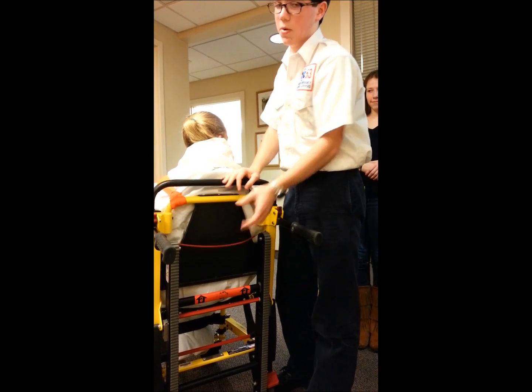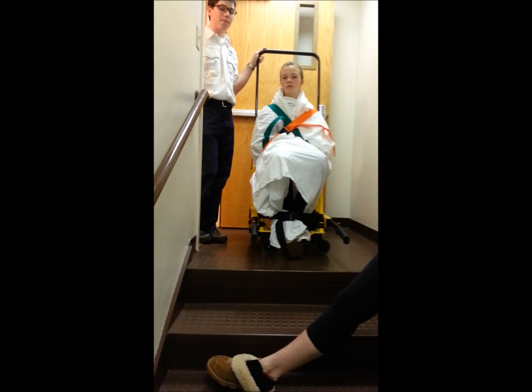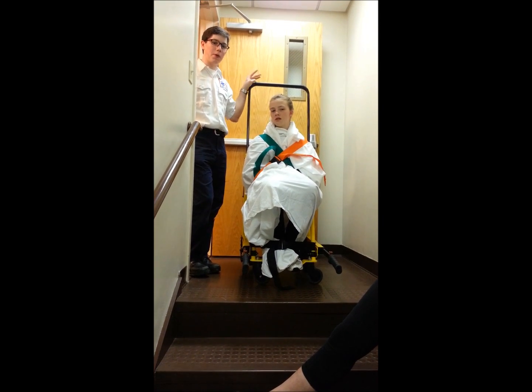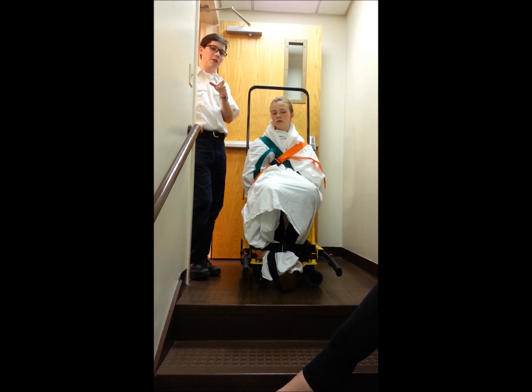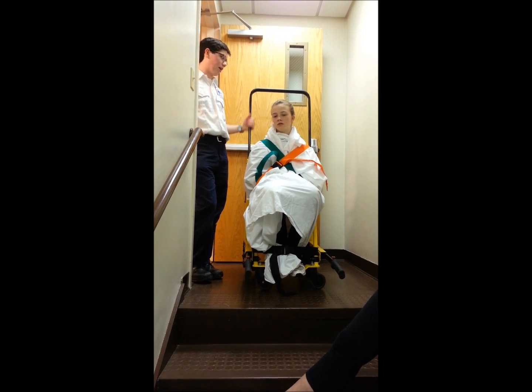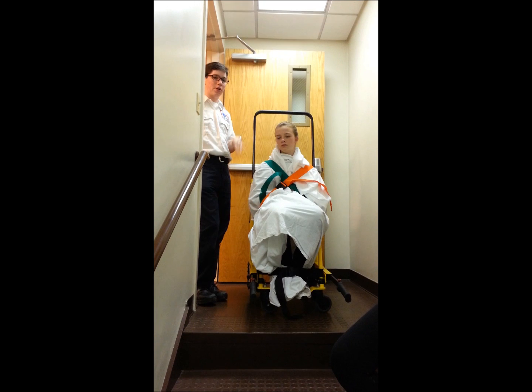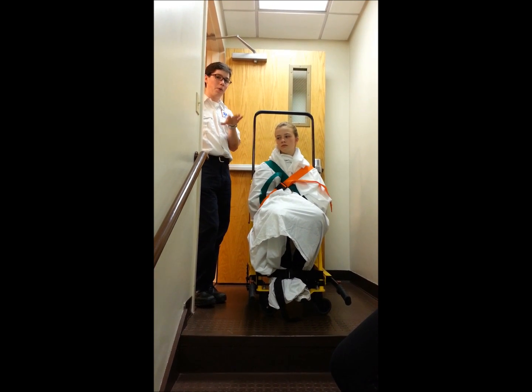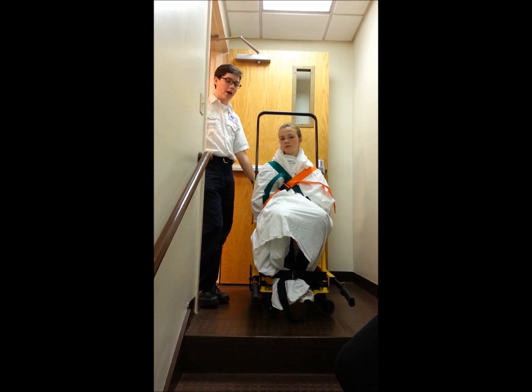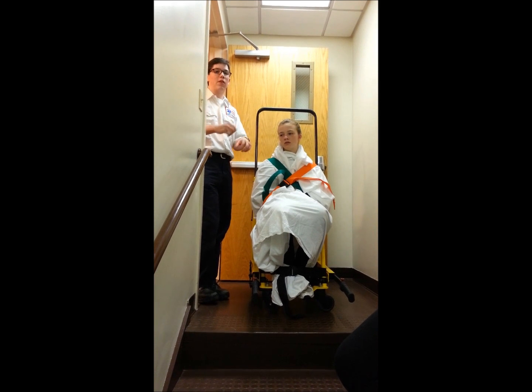So now the next part is we're going to bring this patient down the stairs. In terms of lifting and moving the patient, you're going to have three people: one spotting, one lifting down there, one lifting up here. The person up here is going to have this bar up. Their main job is to put pressure down — it's counter-intuitive, but that's what the treads are for. It helps keep the treads on track; if you lift it up it could loosen them and then the patient slips down.